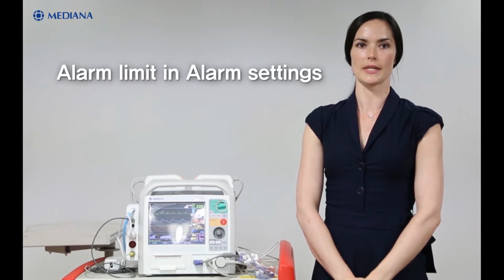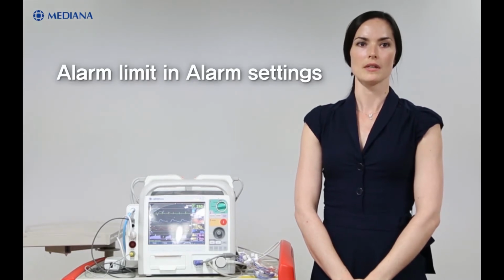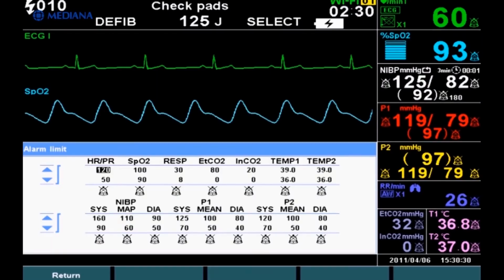You can set the different alarm limits for each parameter. Across the bottom of the screen, there are 4 different soft key menus. Now let's see the alarm limit in Alarm Settings. Here we have a table of alarm limits, and we can set different limits for all parameters by this multifunction knob. When an alarm occurs, we can pause the audio for the audio pause time, but visual alarms continue during this time. The factory default for audio pause time is 30 seconds.